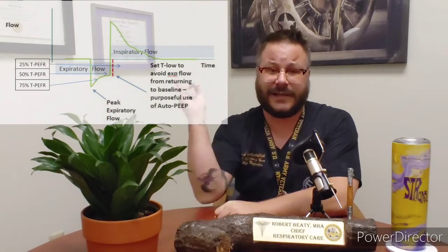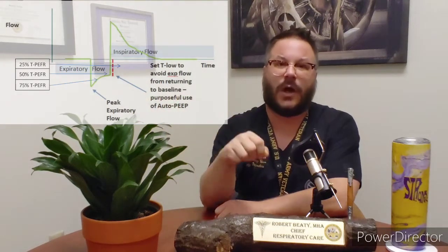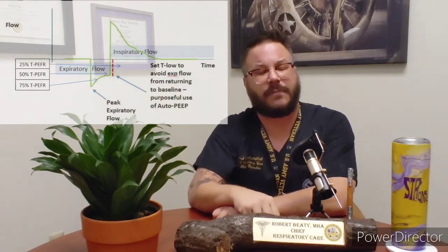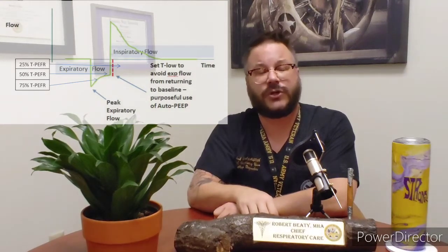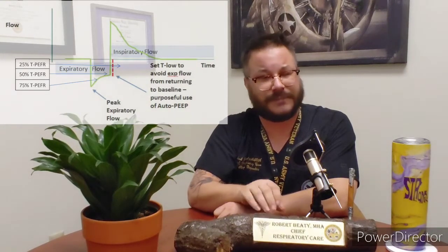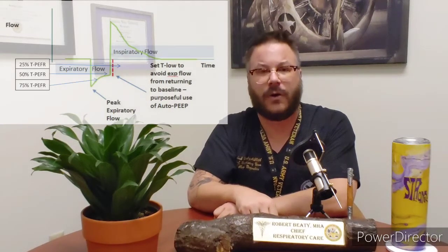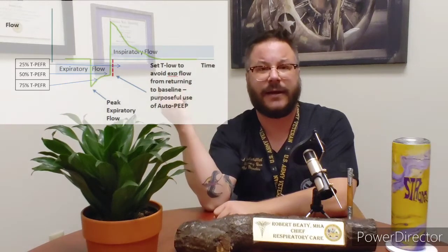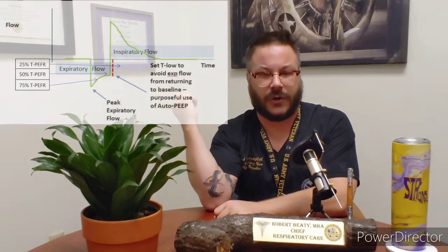Now, because this is actually how we're going to cause our PEEP, pressure low gets often confused and people want to set 5 and 10 and 12 and 15. We should always set, for most 99% of patients, the pressure low at 0. And this is so we don't impede the expiratory flow that we are going to have during exhalation.